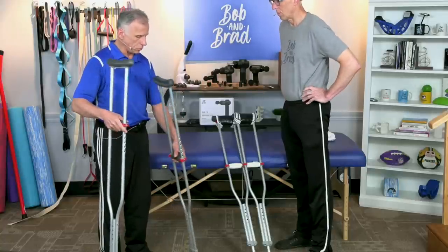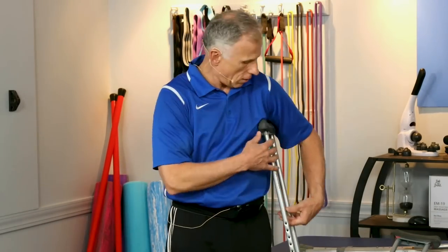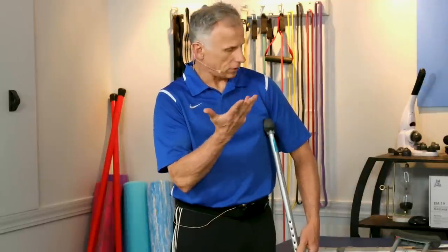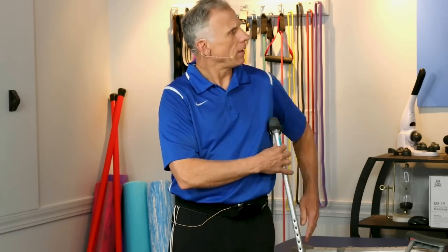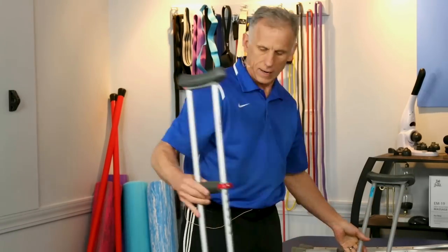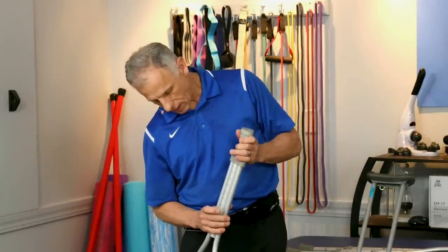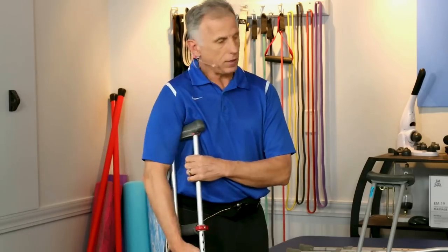While the crutch is there with your feet shoulder-width apart, put the armpit rest right there and see — you should be able to get two, or two to three, fingers in there comfortably. There should be a gap. This crutch is a little tight for me and I cannot adjust it any lower. This one is obviously way too tall. These aluminum ones are so nice to adjust — you just drop them down; they have little buttons that click in and lock.